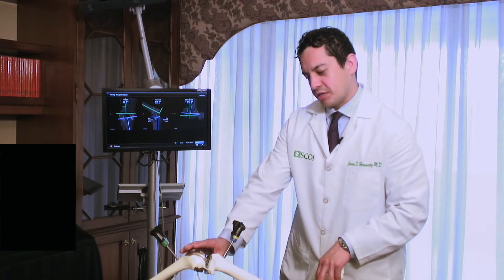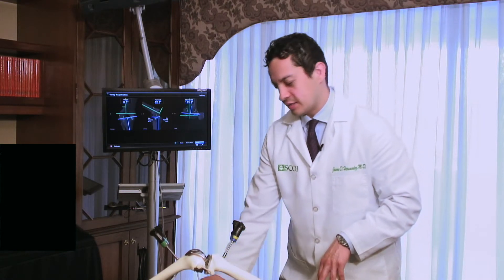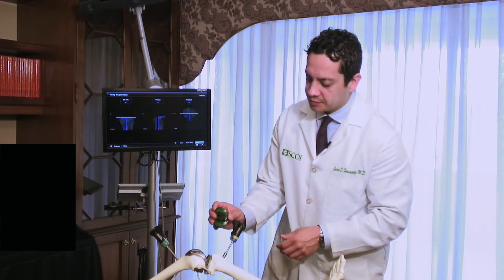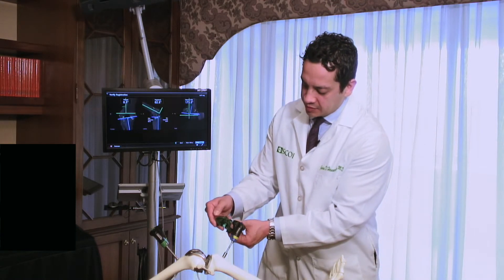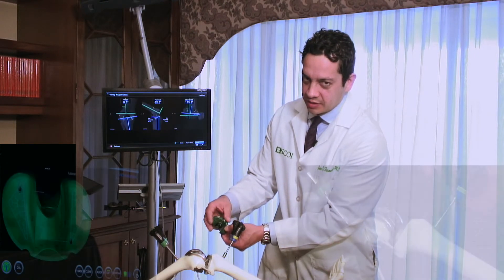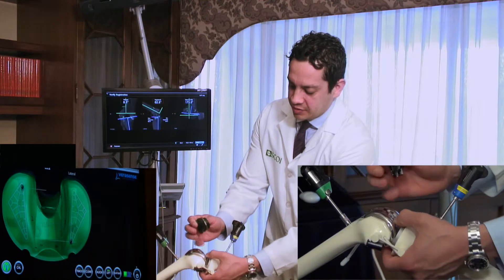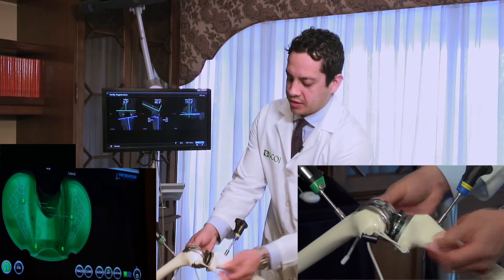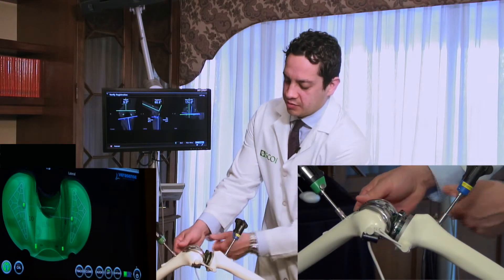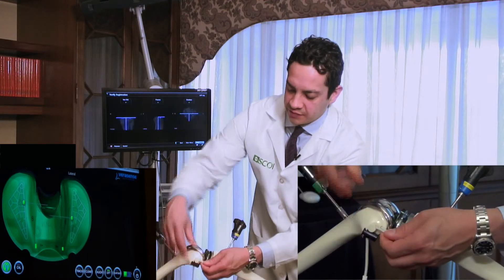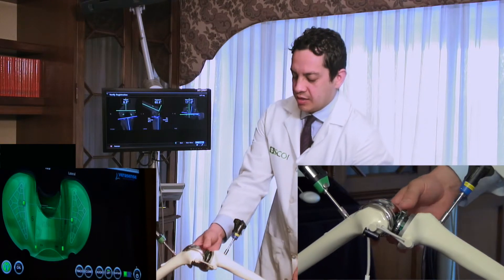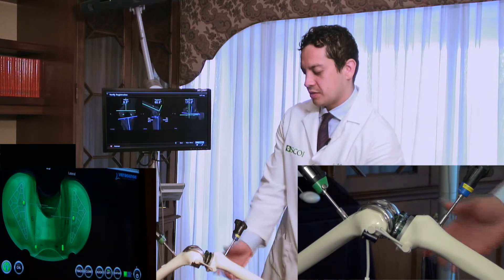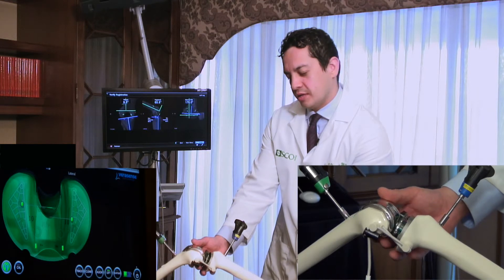The other important part of surgery is the pressure in the knee. Like a tire, you want the correct pressure. I use a little pressure sensor with small triangles that sense how tight or loose the knee is. After the parts are aligned, I insert this pressure sensor and check the patient's pressure — we don't want it too tight or too loose. If it's too tight, we can loosen ligaments; if it's too loose, we can tighten them. A second computer tells me how tight or loose the knee is, and I keep adjusting until the pressure is perfect.